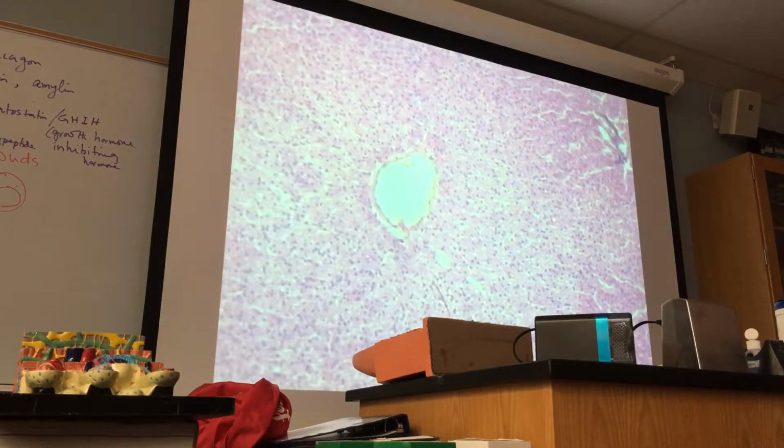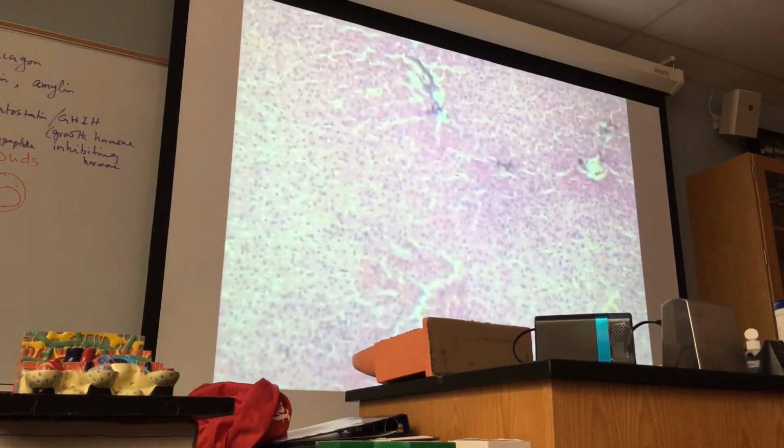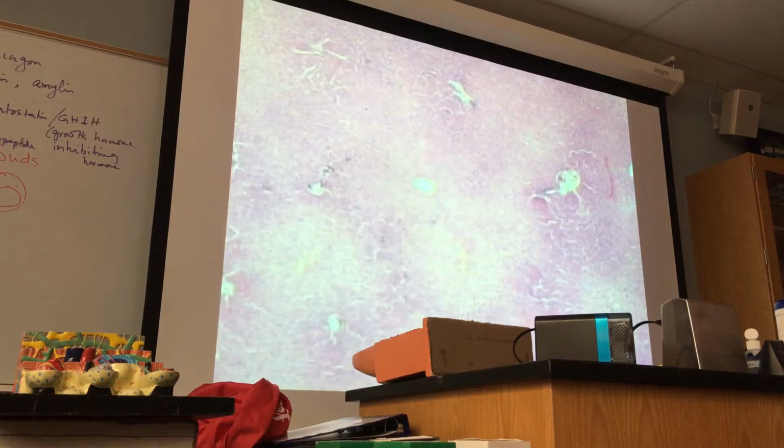So we will go to a corner. One of the signifying features, or one of the signature features, is central vein. If you can recognize the central vein, definitely this is liver. Do you get that? This is an identifying character. But there is another one called portal triad. I will take you to a triad region right now where you can see threesome structure.